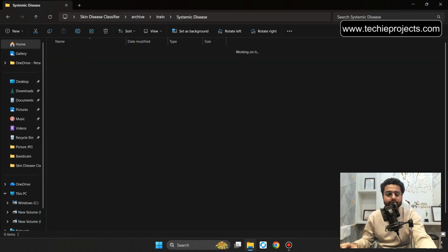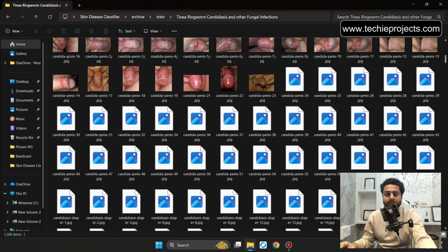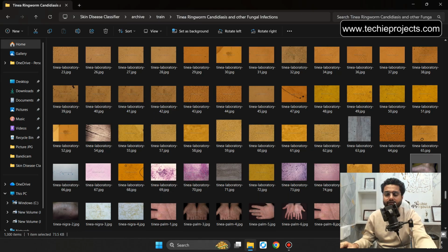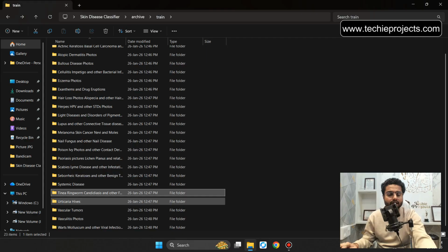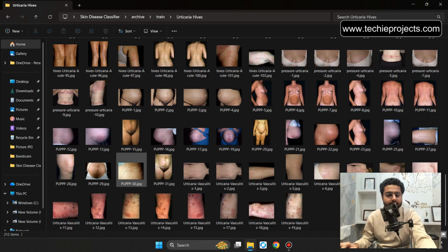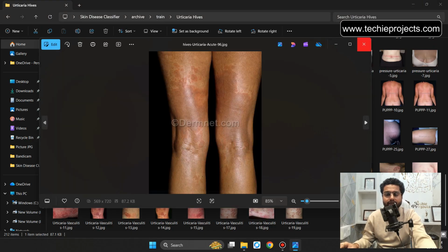Let's go back. Now the tinea ringworm, candidiasis, and other fungal infections. It looks like that. Let's open any of the images. Okay. It will be around 1300 images for training the model. Let's go back. Now urticaria hives. Let's scroll down. It will be around 212 items. Let's open any of the images. It will be like that.